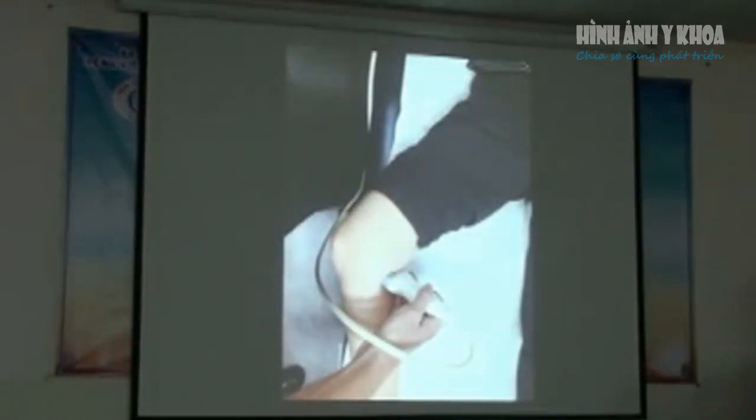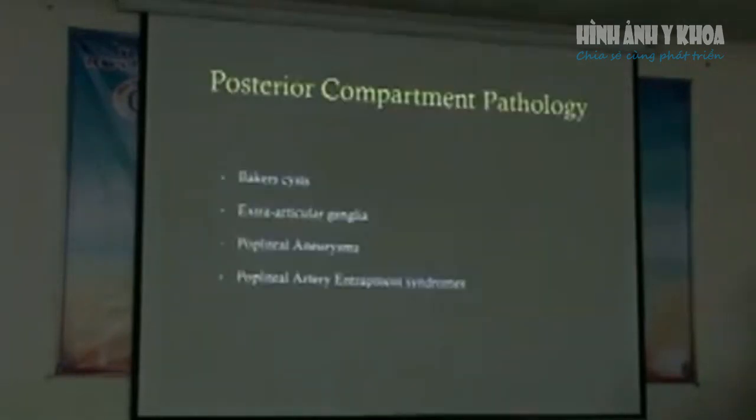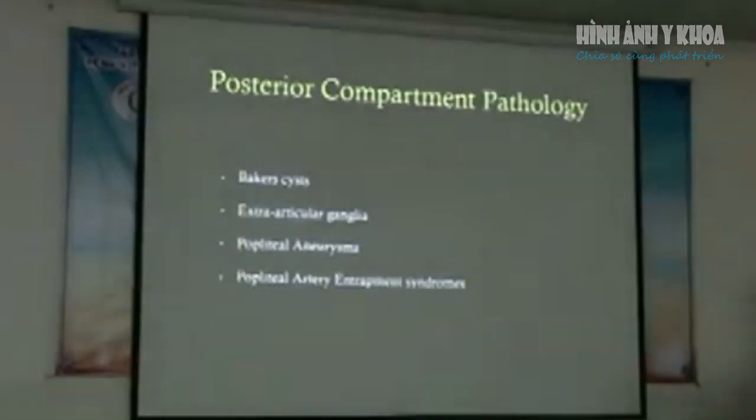So to look at the posterior area, I just get the patient to slightly roll on their side, and then we just approach it more so from the medial aspect. Most of the pathology is going to be in the medial zone and the central zone. Mình sẽ yêu cầu bệnh nhân hơi nghiêng qua phía bên phải hoặc bên trái, để khảo sát cái gối đó và cái gối ngửa ra một chút. Mình sẽ khảo sát với cái vùng bên trong của gối.